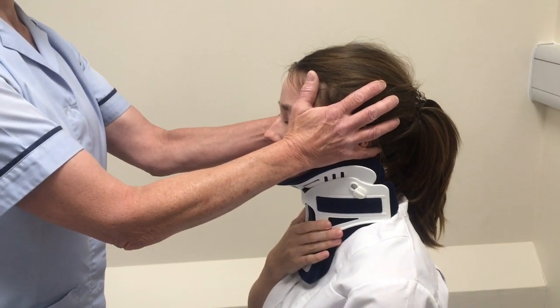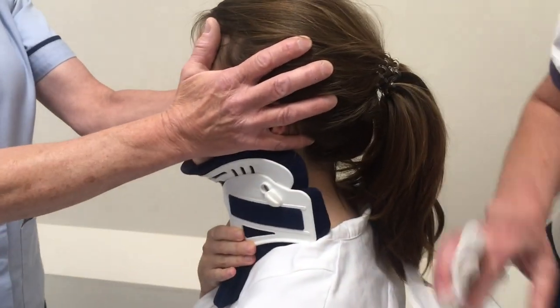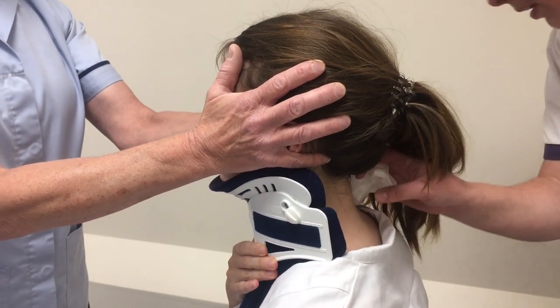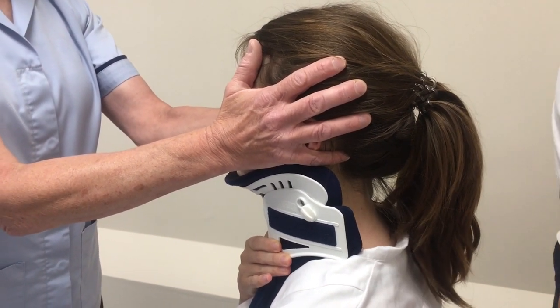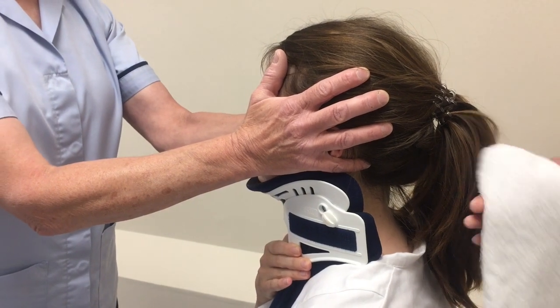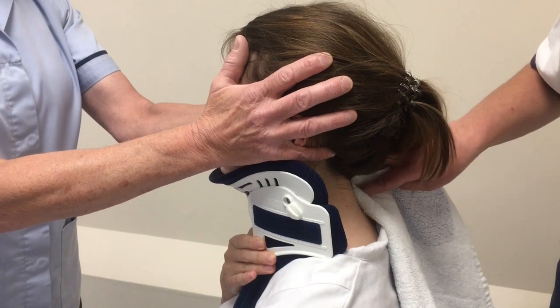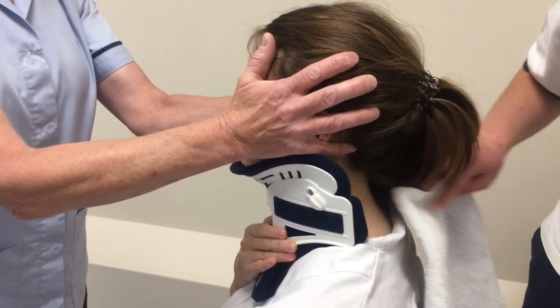Then we get our bowl of water and we can just freshen up the neck and get all the way around. And then just dabbing it dry with a towel.